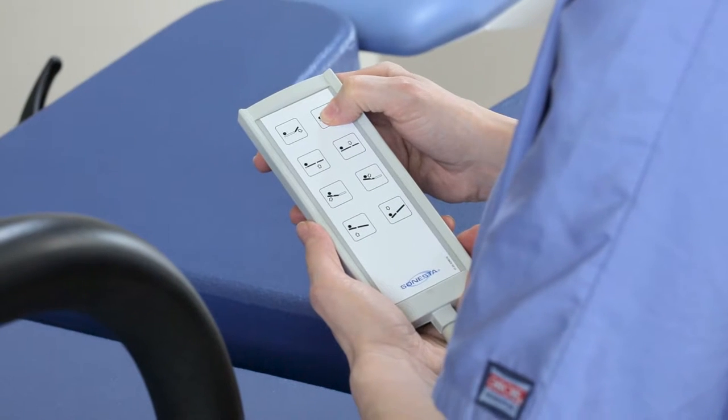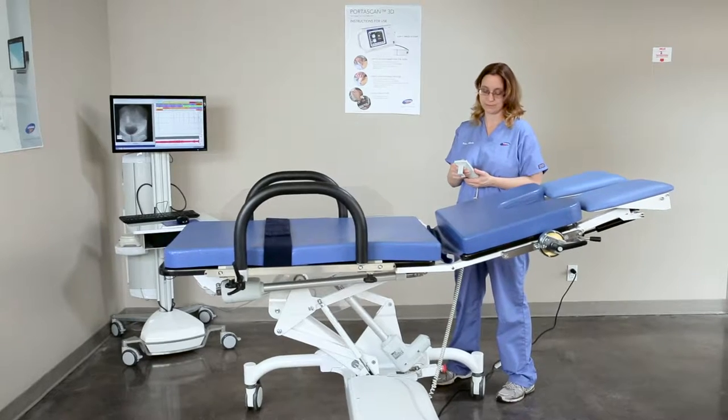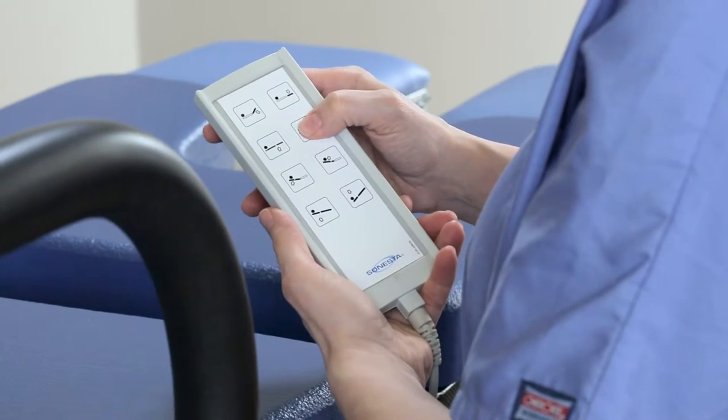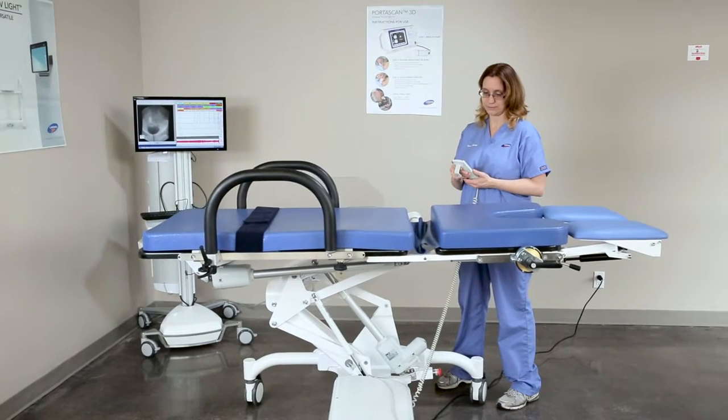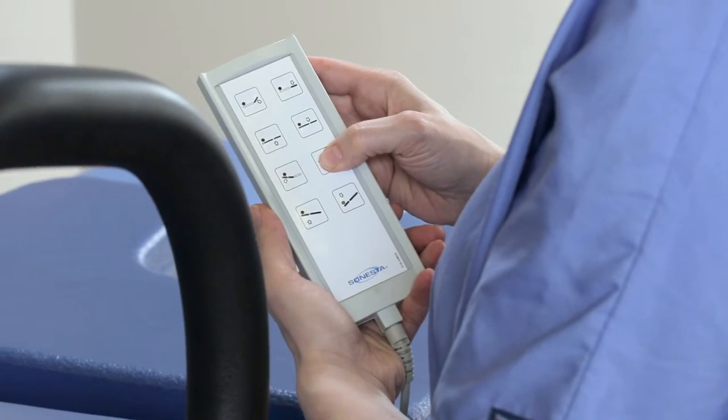There are four pairs of buttons on the hand control for the motors. The top pair moves the chair seat up and down. The second pair moves the whole table up and down. The third pair moves the chair backrest up and down.